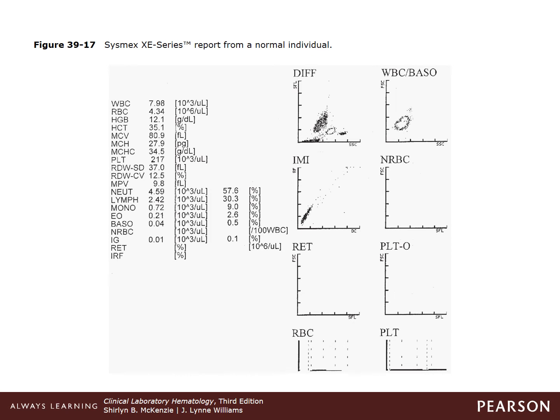These instruments are special because they have an immature granulocyte software that detects the immature granulocyte population. It can count them as metamyelocytes, myelocytes, and promyelocytes and produce a scattergram plot. For the WBC baso channel, the specimen aliquot is diluted and a special lytic reagent breaks all of the red cells and shears the leukocytes except the basophils.